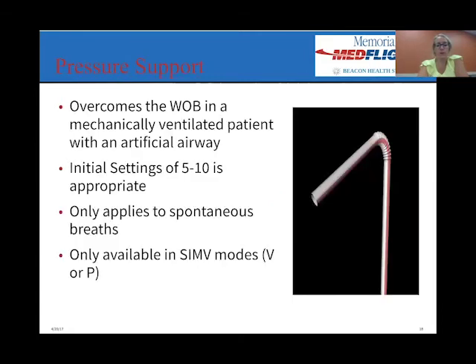Pressure support, I kind of talked about this. This is the straw. If everybody were to take a straw and breathe through a straw, you would increase your work of breathing. It's going to make it harder for the patient to breathe. They're going to have to work harder, and they're going to get sicker. So giving them some pressure support just helps them so they don't have to work as hard, which is going to make it more comfortable for the patient, which is eventually going to lead to being able to get them off the vent sooner because they won't have to work as hard.